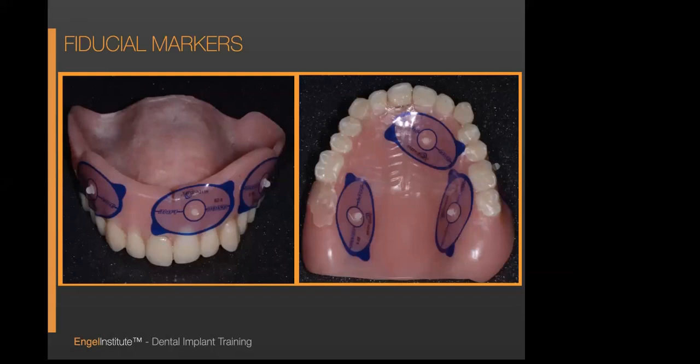The reason I'm telling you that I want you to do the second one before the first one is because when you put this in the patient's mouth, these beads can get moist. And if they get moist and they slightly move, it will not match your second scan. So do the dry scan first. This being the dry scan, the scan of just the dentures, okay?